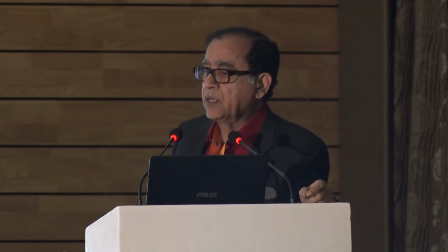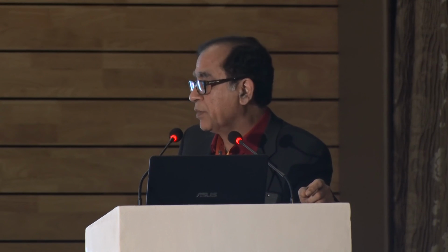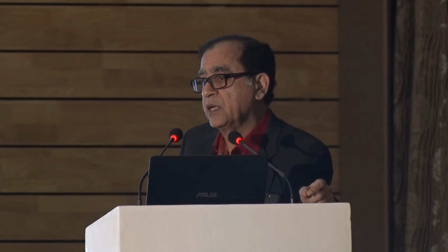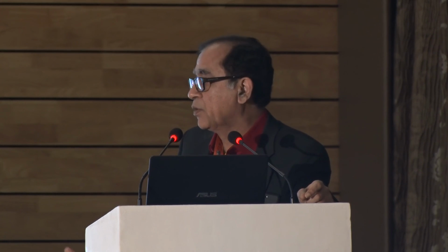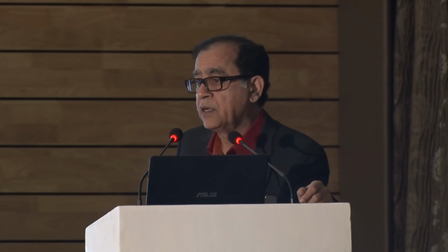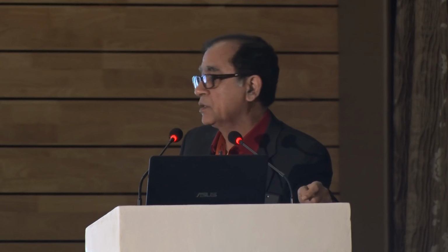And we know that whether to go for a toric IOL or not will be debatable in such cases, because in the presence of the PCR there are high chances of decentration taking place. But this patient had around 5 diopter of astigmatism, so we thought we'll go ahead and put the toric IOL. If need be, we'll explant it instead of putting the patient through the laser machine. There's another option that you put in a monofocal IOL and then do the LASIK laser afterwards, after 3 months.